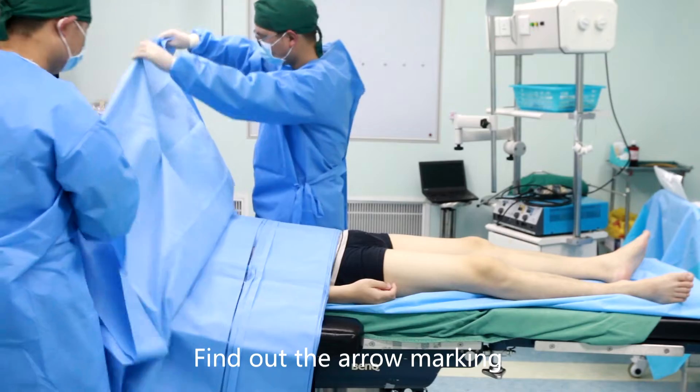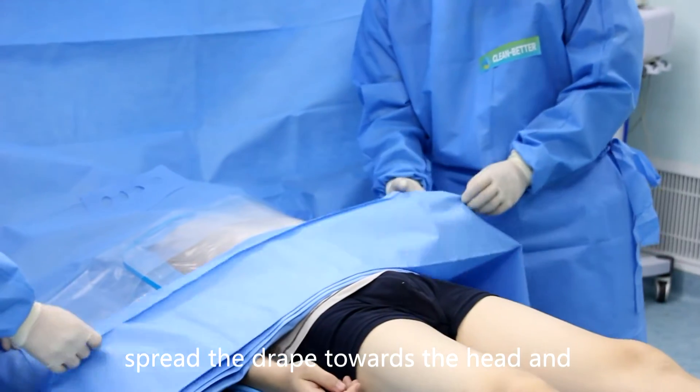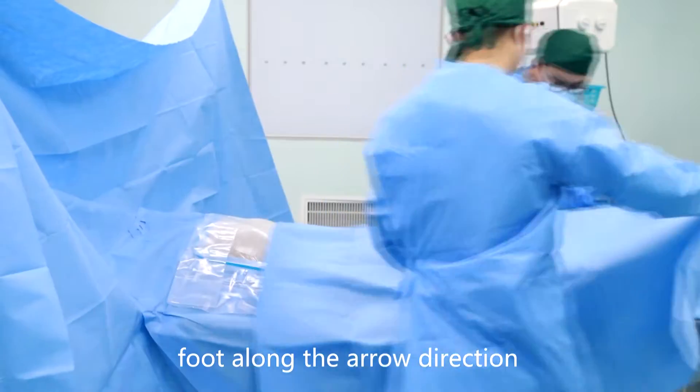Find out the arrow marking. Spread the drape towards the head and foot along the arrow direction.